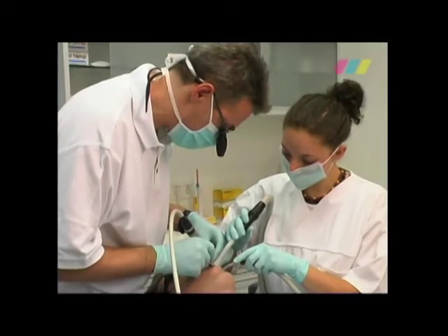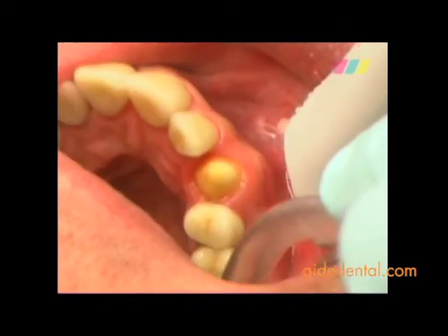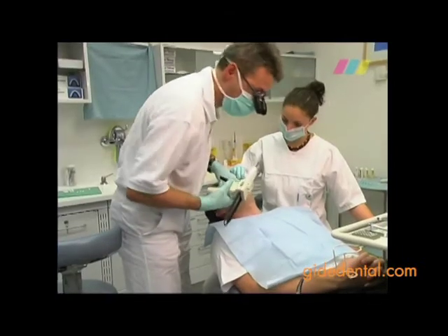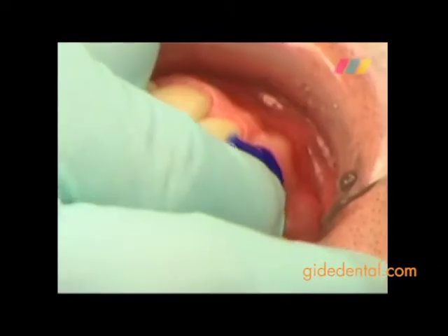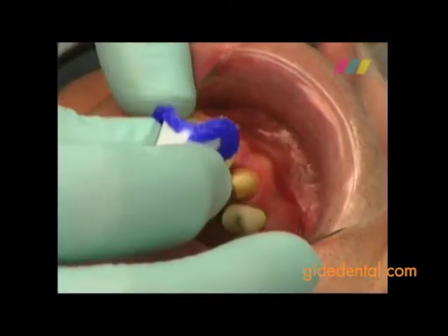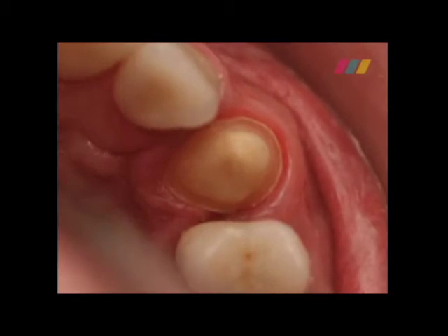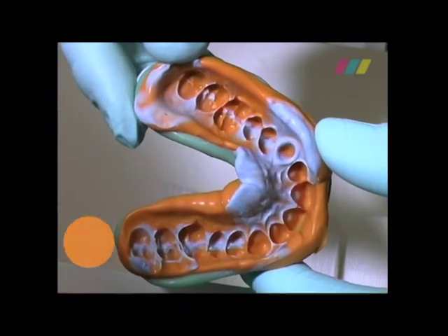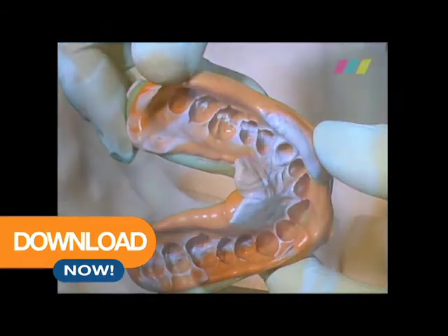An old all-ceramic crown on the upper right canine tooth has fractured and has to be renewed. Magic foam cord is applied to the moist preparation margin in the sulcus. Then the anatomically formed compracat is placed over the preparation and held in position with light pressure. Efficient and gentle sulcus retraction using magic foam cord results in perfect impressions, even for deep subgingival preparations.